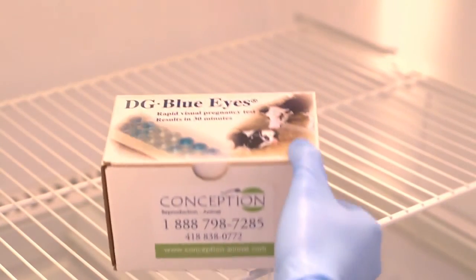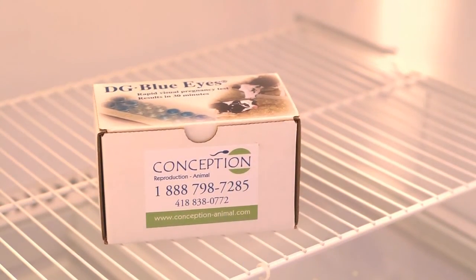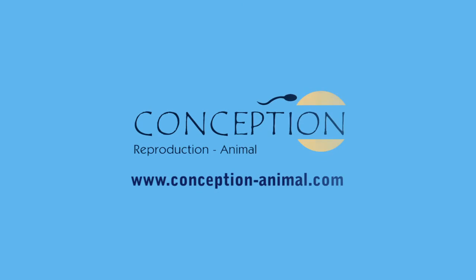Put the kit back in the refrigerator at a temperature between 2 and 8 degrees Celsius immediately after use. To order the DG Blue Eyes Bovine Pregnancy Test, visit our website at www.conception-animal.com.